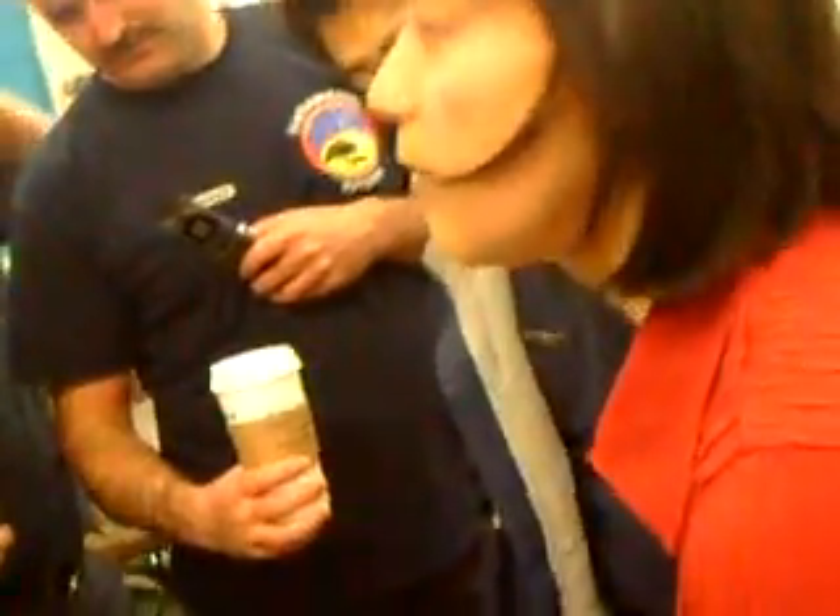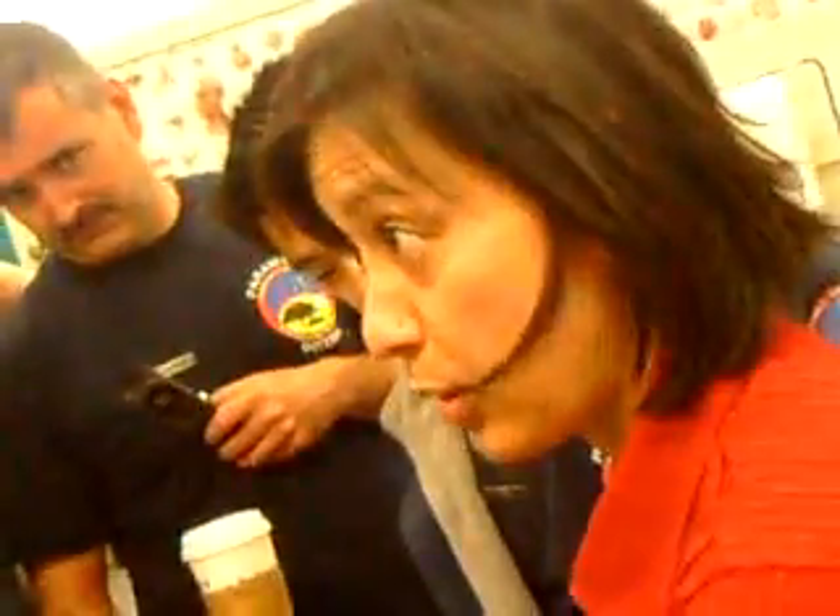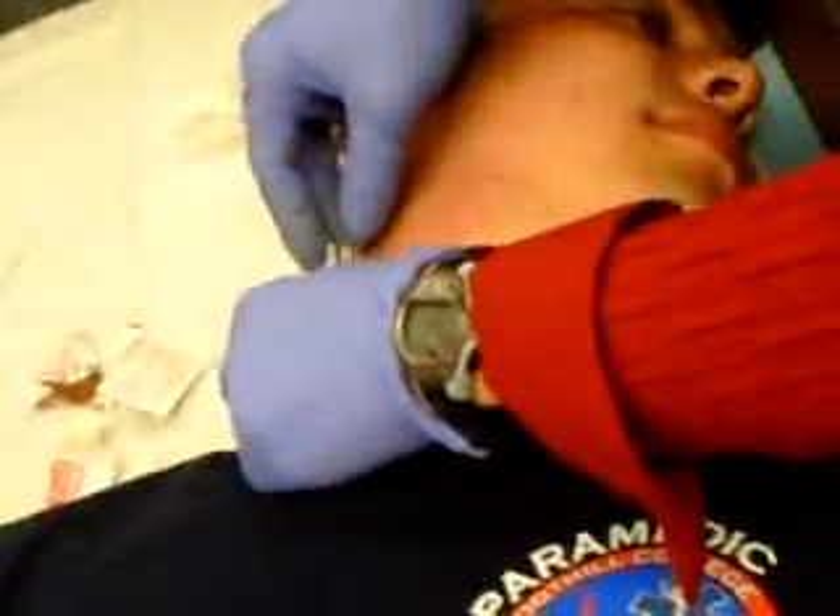Neck EJs are very thick. A lot of times you'll hear a pop. And the other thing is the skin on the neck is a little thicker than the hand or the arm. Or some people just have it because there's sun on your neck. Can we see how the blood flows through? So I can feel for the end of the catheter there and just tamponade it.